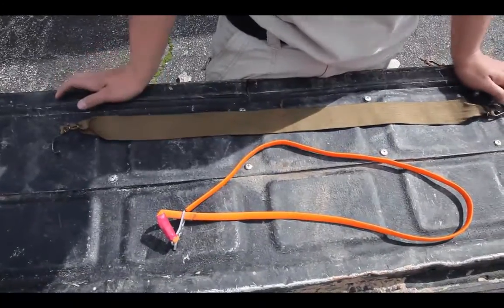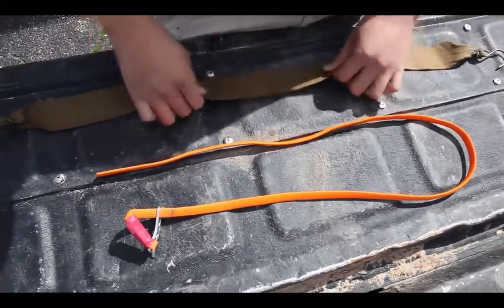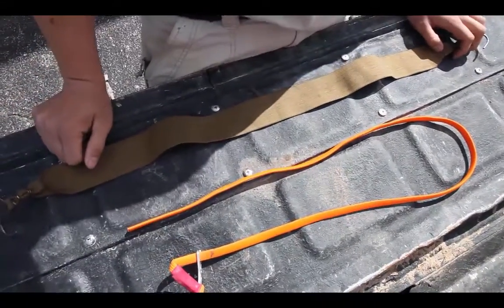Both of these tourniquets are elastic-based, meaning they're like bungees — they've got pull on them. The other type of tourniquet out there is a windlass type of tourniquet, which would be something similar to one of these right here.